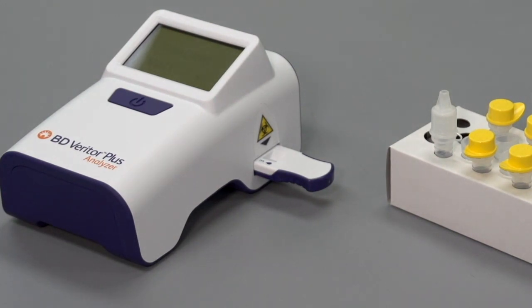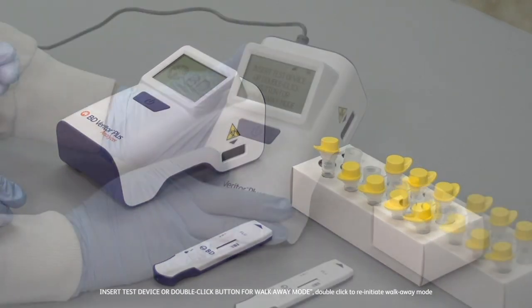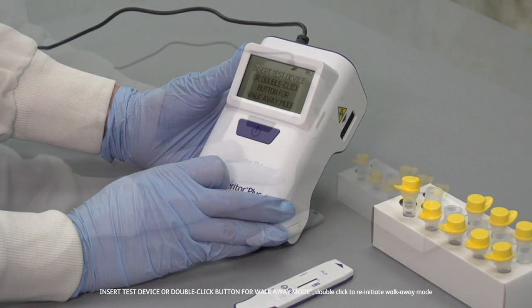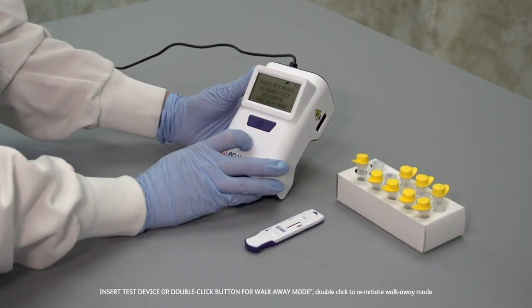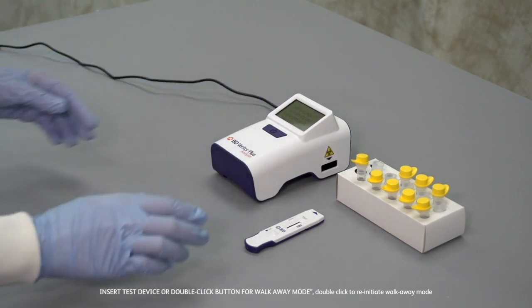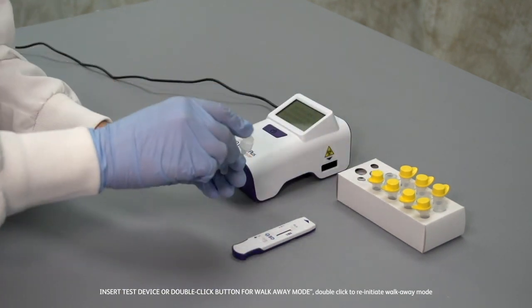We'll do a simulated walk-away test. Power on the analyzer. When Insert Test Device or Double-Click button for walk-away mode appears in the display window, double-click the Power button. You'll be reminded to connect the external power if the analyzer is not already plugged in. This is a requirement for walk-away mode. Make sure the instrument is resting on a level surface.